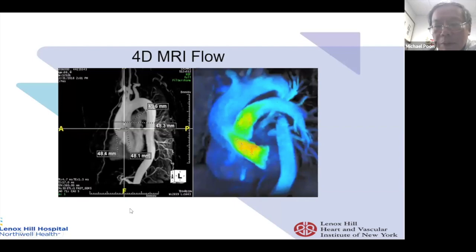We often do these types of non-invasive imaging. We'll pick and choose. Ultrasound is the easiest, right? And it's a tiny machine. I can move it from room to room. But the image of ultrasound is not very good. It's not as clear. It's not three-dimensional like the way the CAT scan and MRI are able to give you a panoramic view of the entire body so you can see other pathology. So ultrasound is fast and quick and easy to obtain, but not much detail.